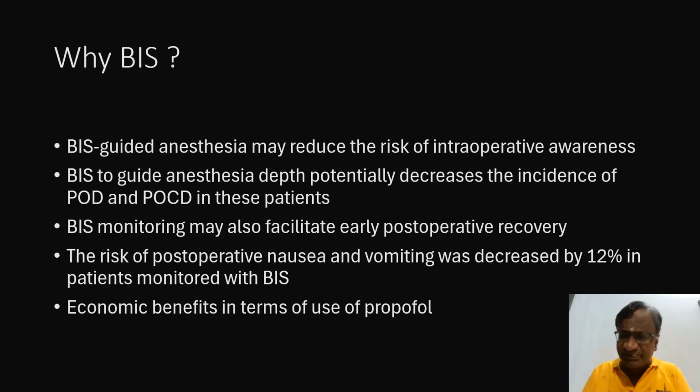So why do you want to have this depth of anesthesia monitoring and BIS-guided management? It may reduce the risk of intraoperative awareness. Now you keep it around 40 to 50, and we are sure that there is no awareness. BIS to guide anesthesia decreases the incidence of postoperative cognitive dysfunction. Now there is no awareness, clear, so there is no POCD. And you need to give slightly less anesthetics, and recovery is better. Because we are giving less anesthetics, possibly PONV is also less.